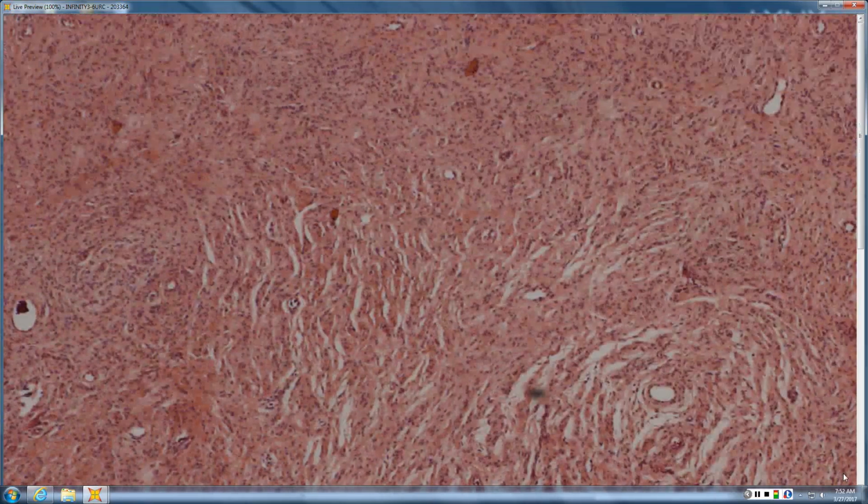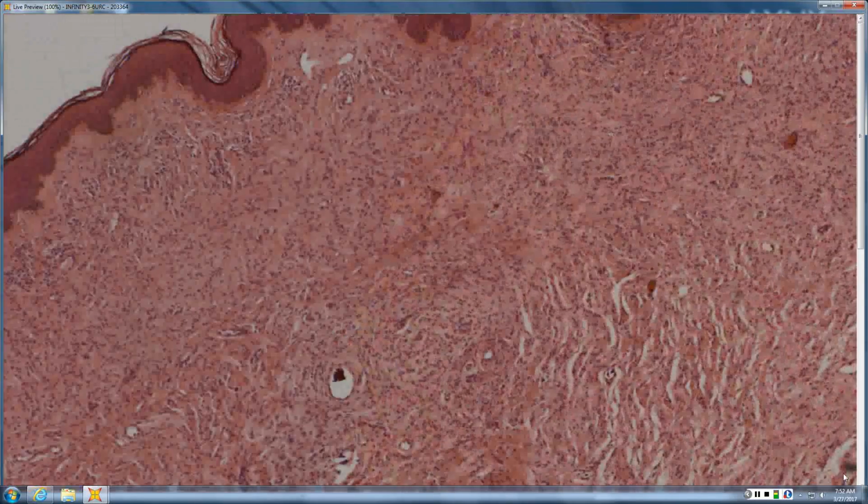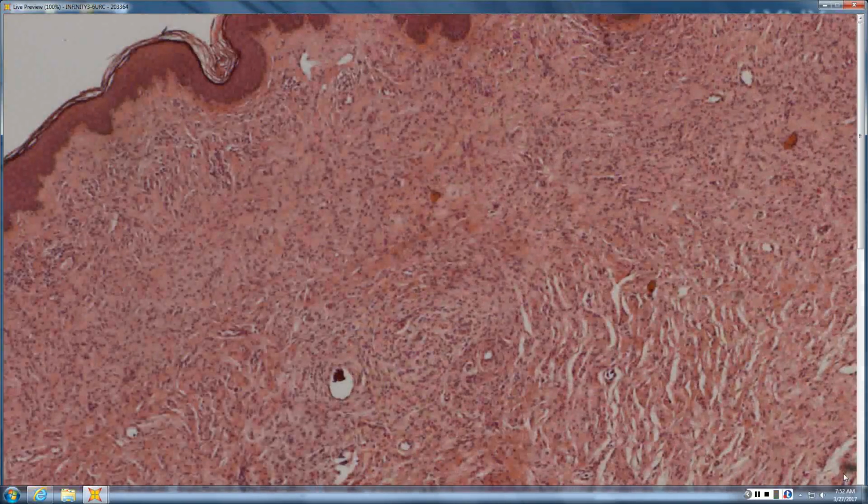Okay. So it looks like a neurofibroma. So why neurofibroma? It's all pretty monotonous, and the cells look kind of wavy from here, like dolphins jumping, kind of myxoid in areas. Yeah. And there are probably mast cells if you go down closer and look for them. So kind of diffuse, myxoid, not broken into fascicles.